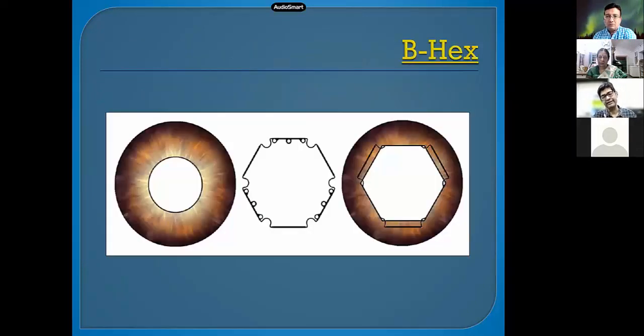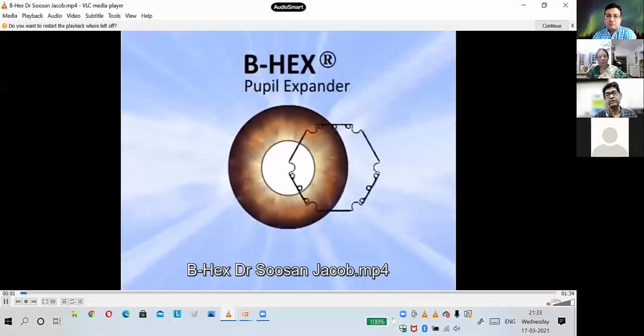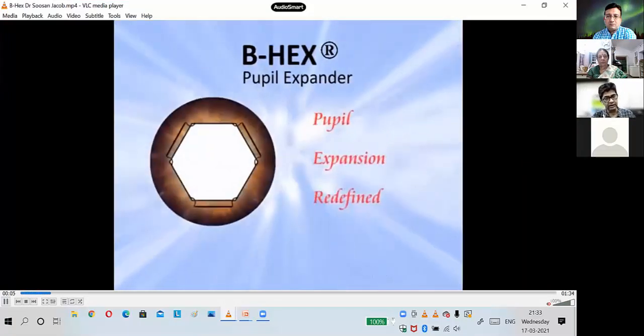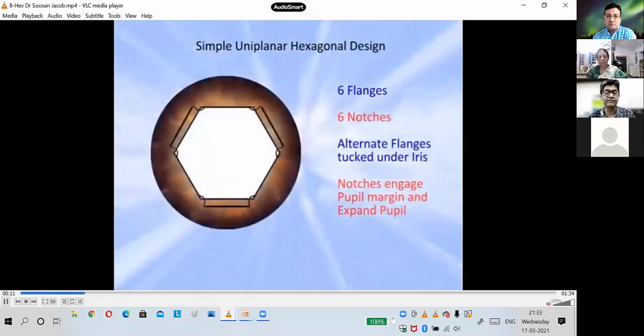This is the B-hex. Actually, it's a hexagon. And a hexagon is supposed to be a very strong shape, giving quite a lot of support with a lot of perimeter area. If you want to see it at work, this is one of the best videos I picked up from YouTube. I do keep B-hex as a backup, but fortunately or unfortunately, whatever way you put it, I've not had the chance to use it yet.